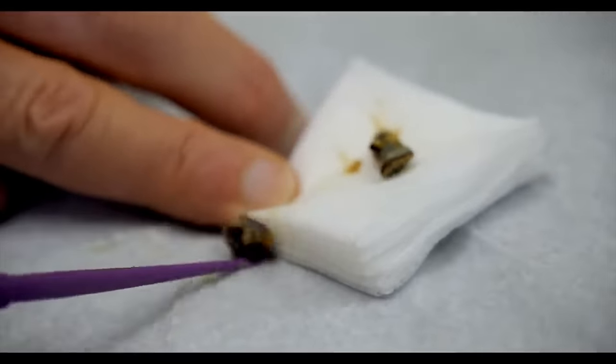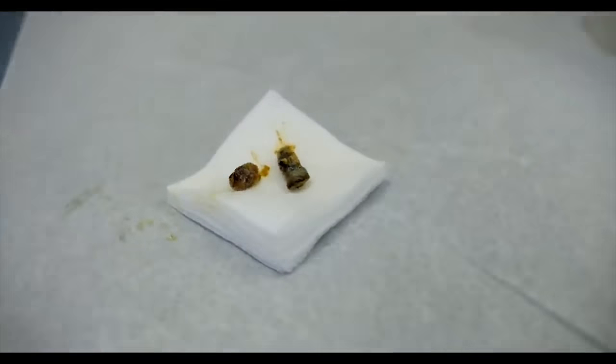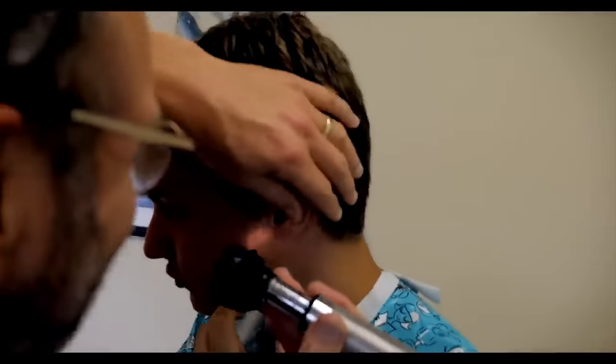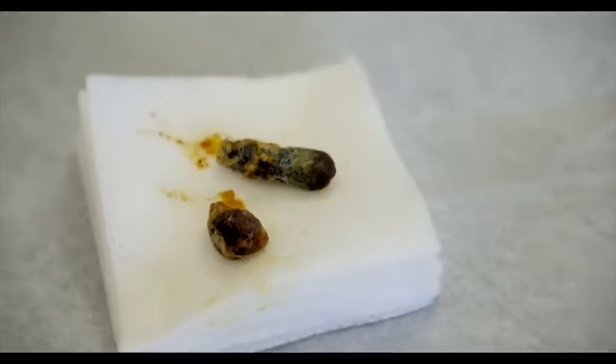Jump in, Max. Jump in. There you go. There might be more. I can feel it — I just felt it open up. Let's see it — it was popping in there. I think I actually can see all the way to the eardrum. I see gray — I can see the gray eardrum. Nice. A new technique here: handheld camera with an otoscope. We have a video that has 30 million views that didn't have this much earwax.